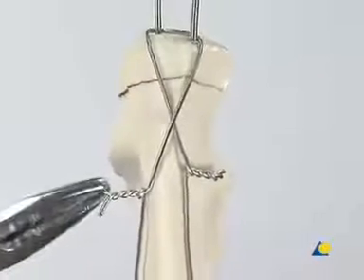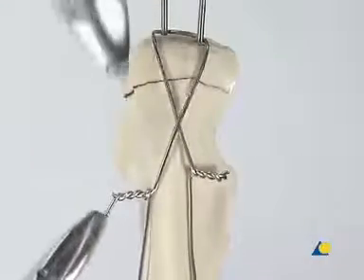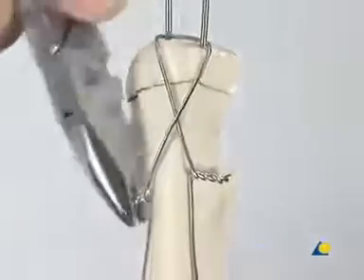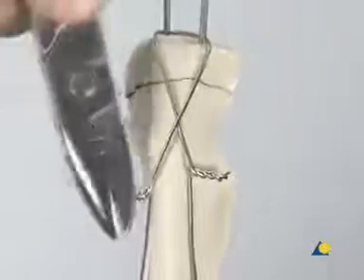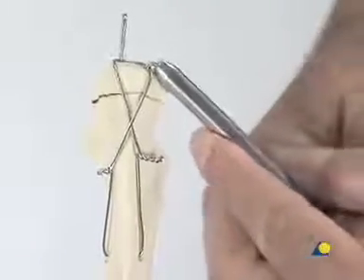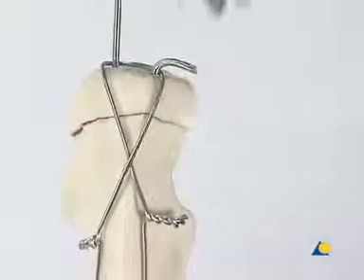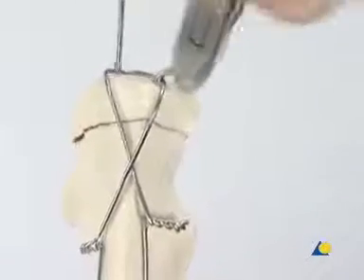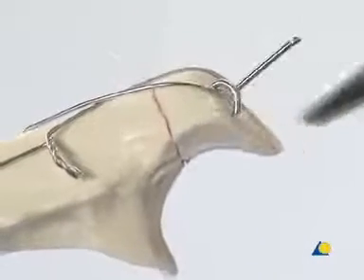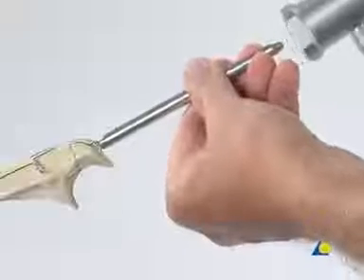This step is repeated on the other side. With the wire bending iron, the K-wire is bent approximately 120 degrees. The K-wire is trimmed with the wire cutter. The K-wire is then bent further using the wire bending pliers so that the end of the wire can be inserted into the bone. The wire is rotated so that the cut end lies on the posterior aspect of the olecranon. Using the bending iron and the hammer, the K-wire is impacted into the olecranon.